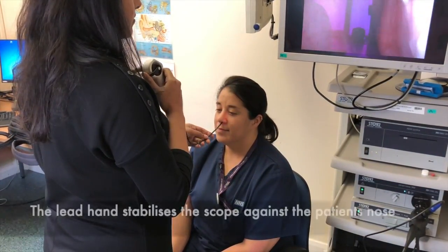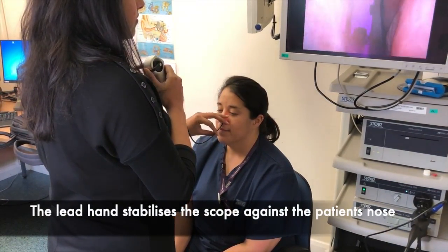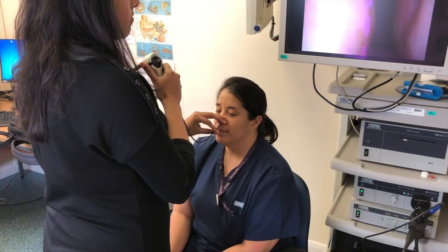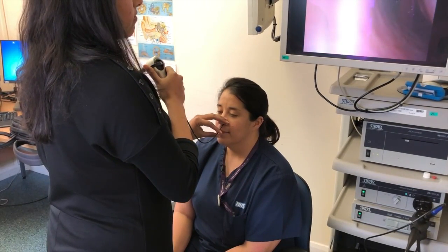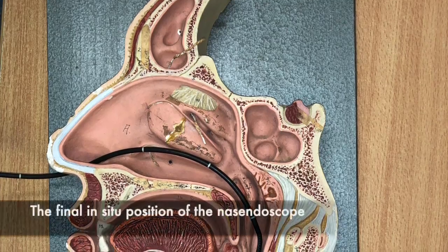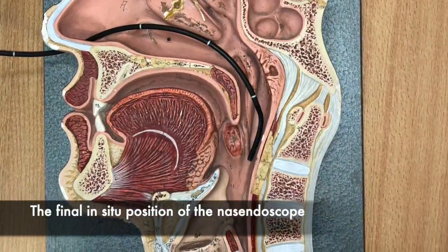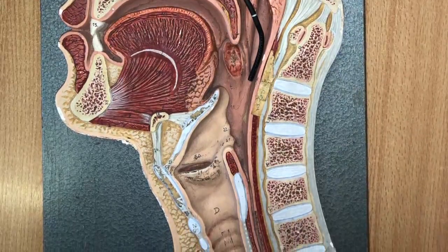Gently pass the endoscope into the nose and use your lead hand to stabilise the scope against the patient's nose. This image demonstrates the eventual depth to which the endoscope should reach.